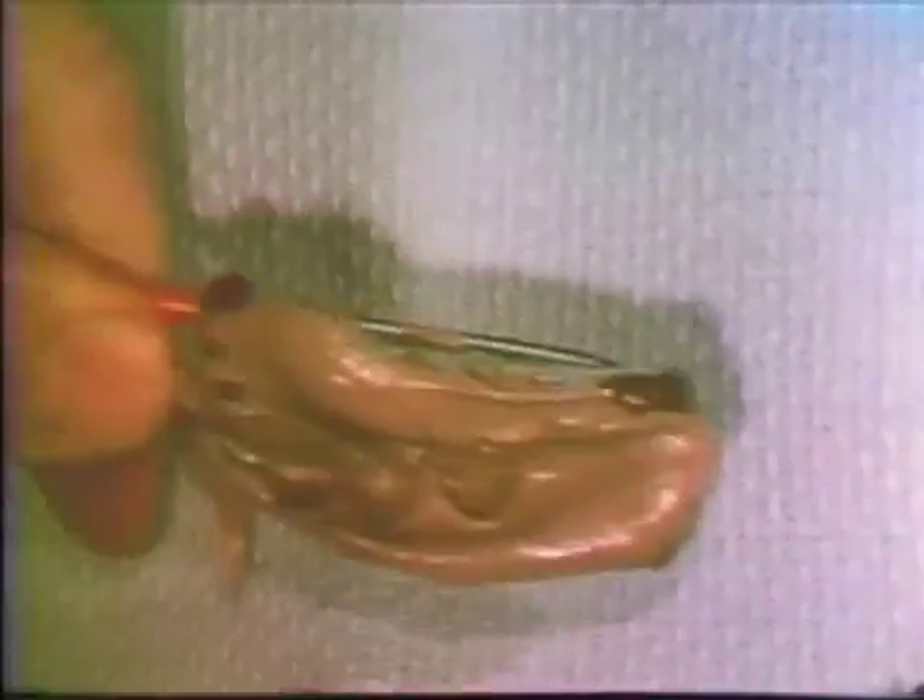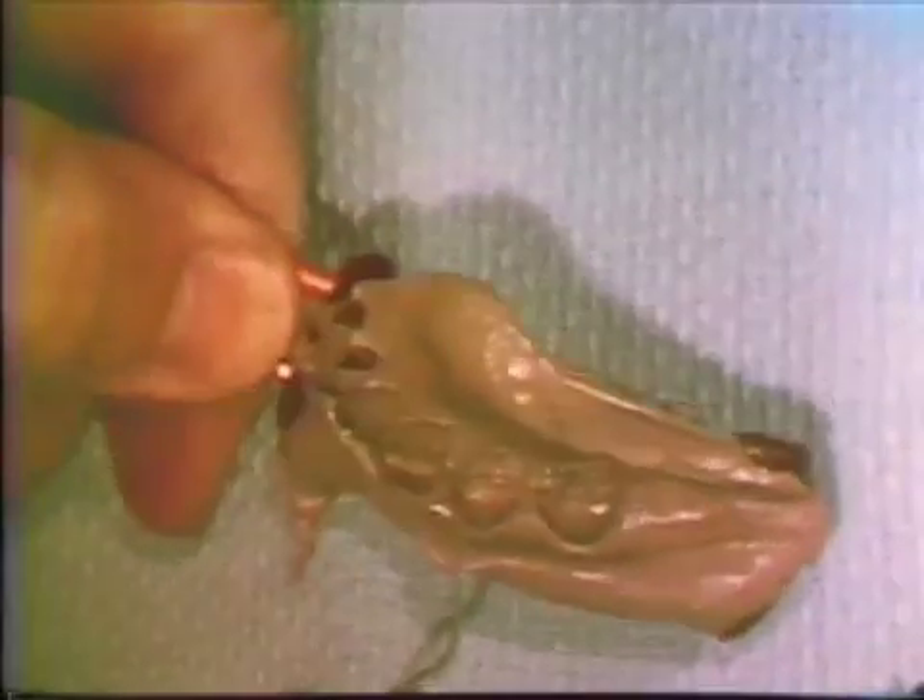The interval between administering the anesthesia and the beginning of tooth preparation provides an opportunity to record an impression for the construction of temporary crowns after the preparations have been completed. A small stock tray can be utilized. A heavy-bodied rubber impression material can be used for this impression. As soon as the material has set, the impression is removed and inspected for accuracy and detail.